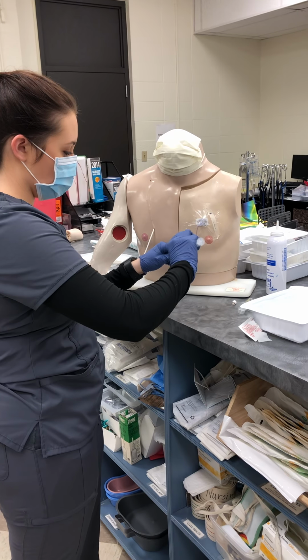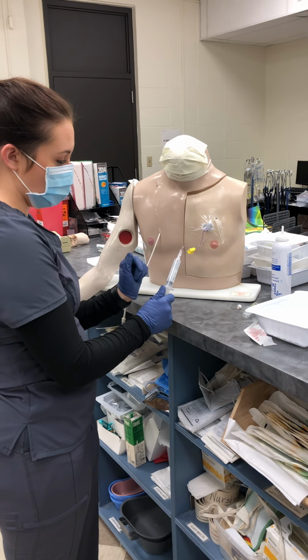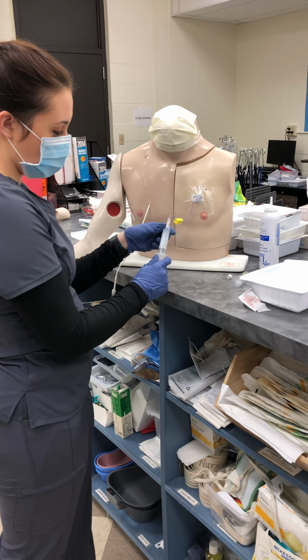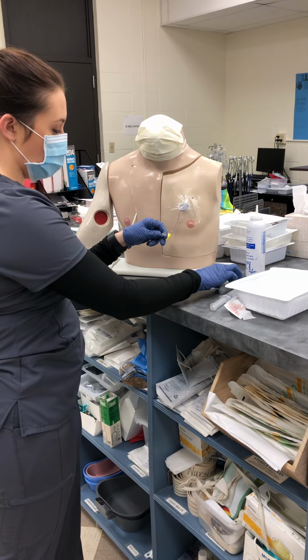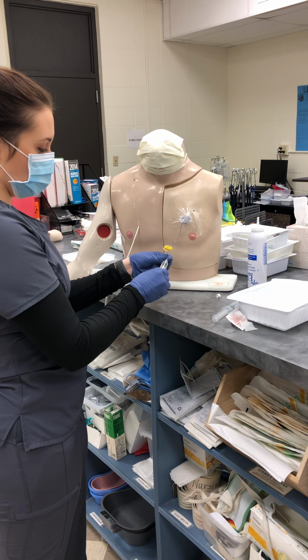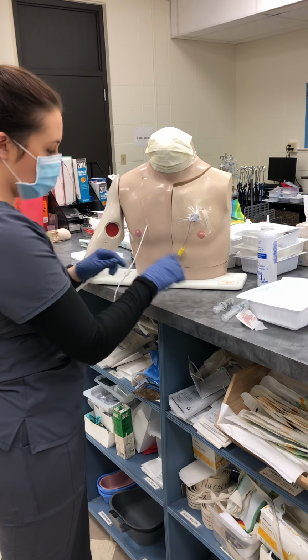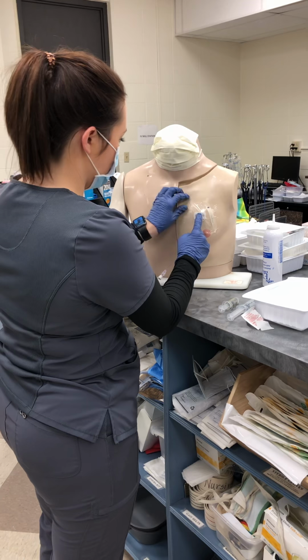I'm going to aspirate, again checking for that blood return. So we have our flashback. Now we're going to flush with our 10 ml syringe. We're going to flush with our 5 ml syringe of heparin. Okay, I'm going to put our cap back on and clamp it. Now we're going to take off the dressing and remove the needle.